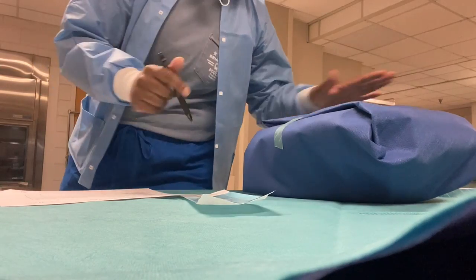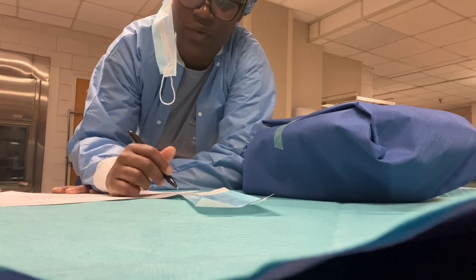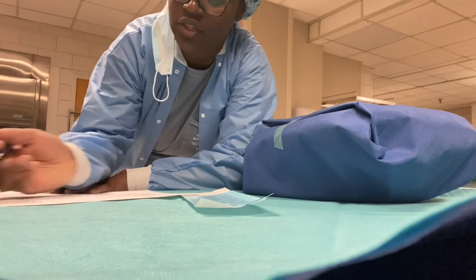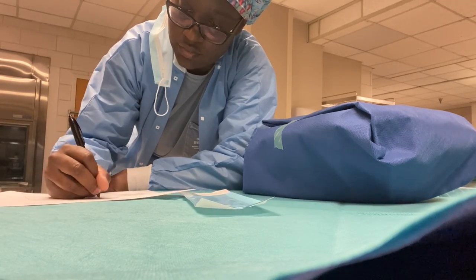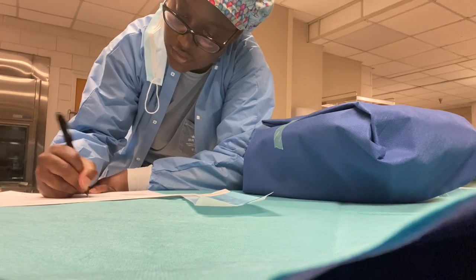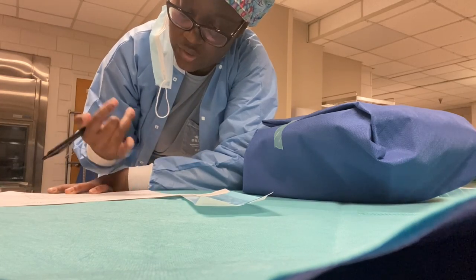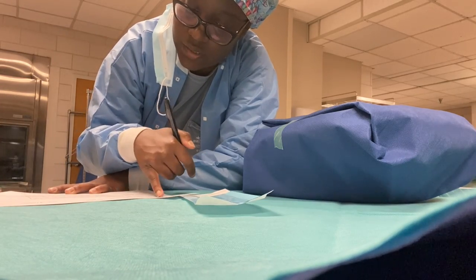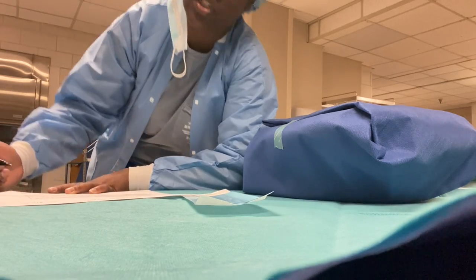So this vaginal pan set was number 8. So I already have that at the top of my page. I have the date. And I'm going to fill out how many it was. Which everything was correct. We did it all together. Sometimes you may get one and only have one small bowl, or you may get 0 leg bands, so you need to make sure to fill that out. And put your initials at the bottom.